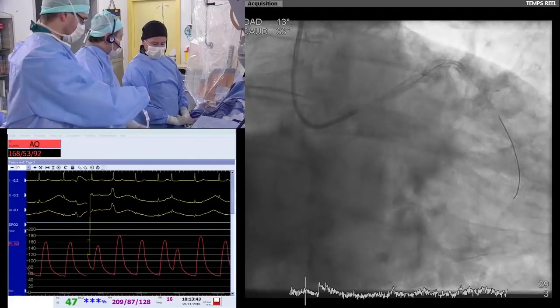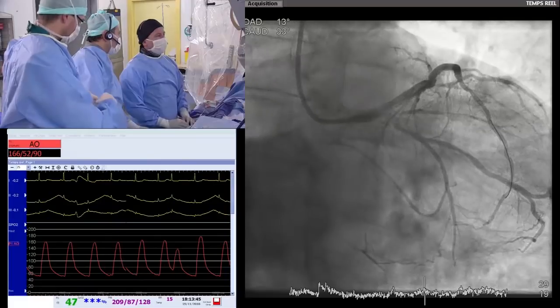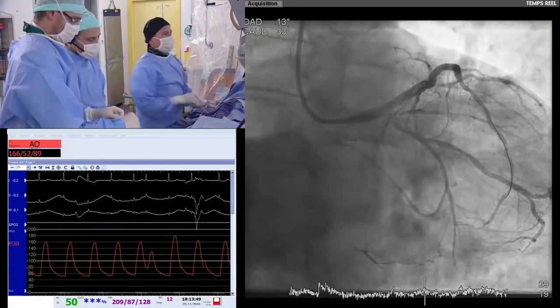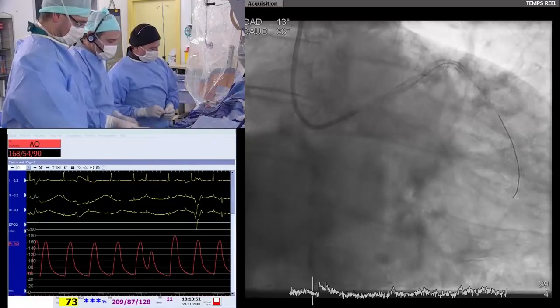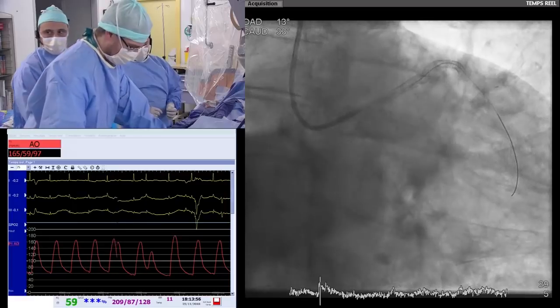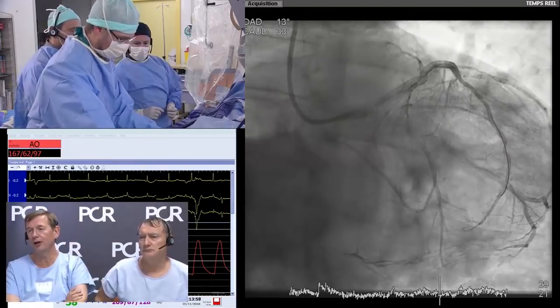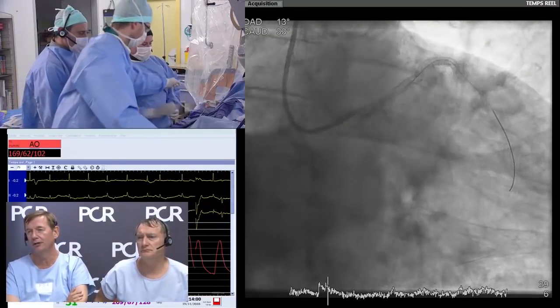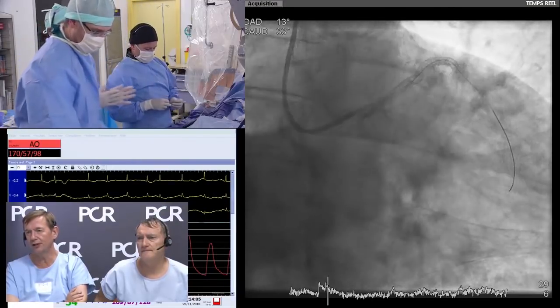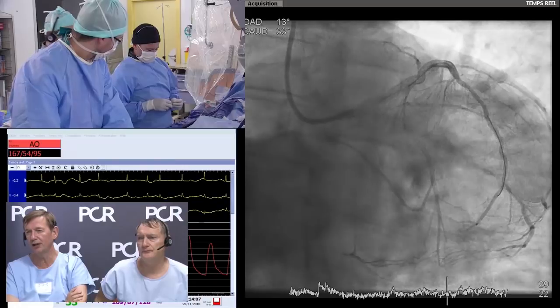Perhaps what could be useful is just to do a run with IVUS. We assess the stent. Yes. We will do an IVUS and we will decide. How do you feel about the result, and what do you think we should do? Well, it's an astonishing result. You should be very proud of an incredible demonstration of how to look after severely diseased, diffusely calcific disease of both the LAD and the left main.